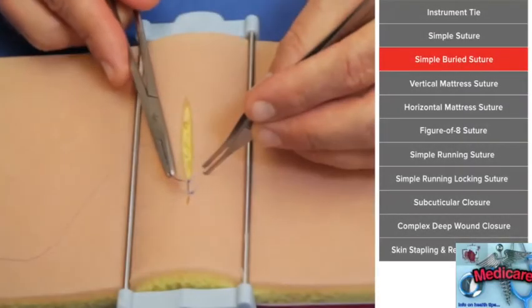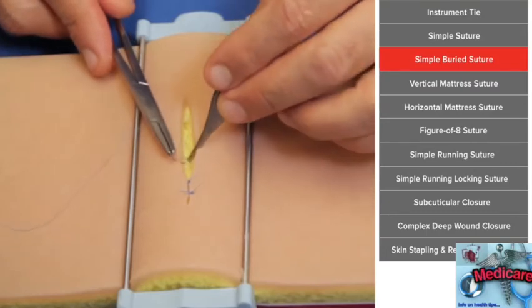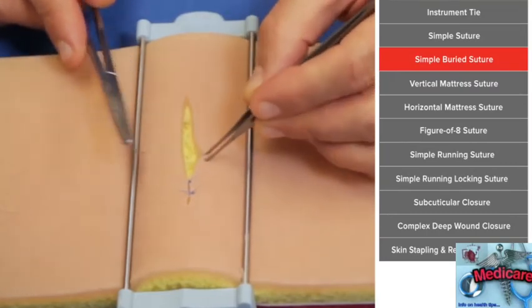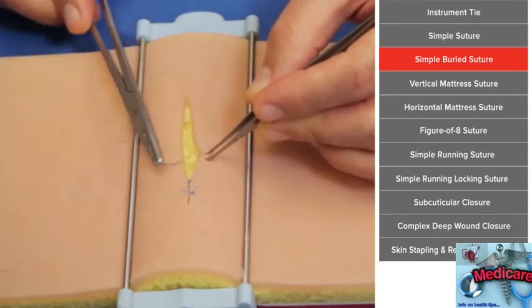Now I'm going to show you a simple buried suture. These are the sutures that we use when we're trying to reapproximate the skin, usually with absorbable suture, and then either gluing or steri-stripping where we're not doing a skin layer.